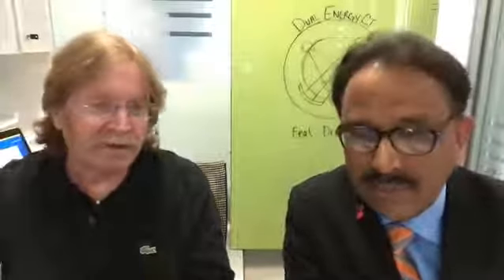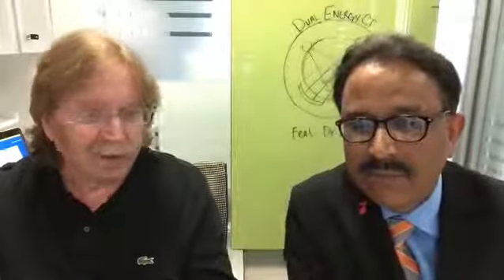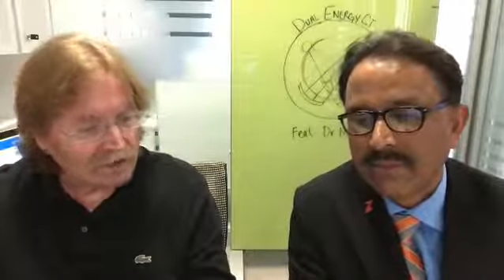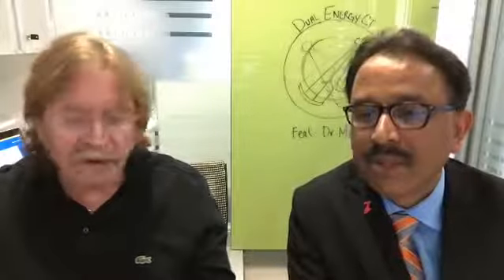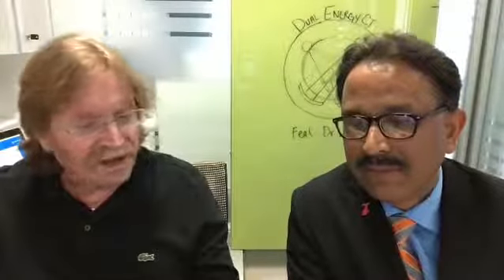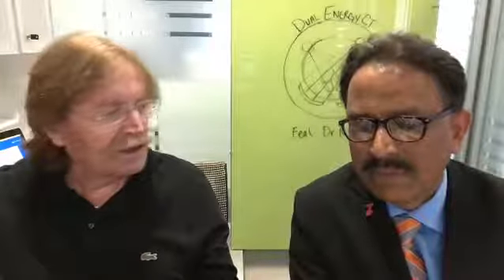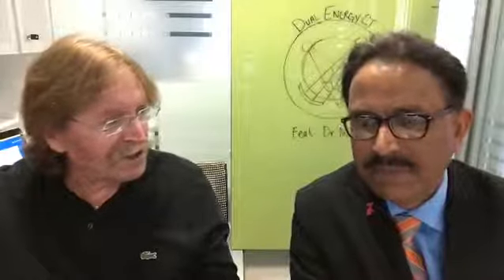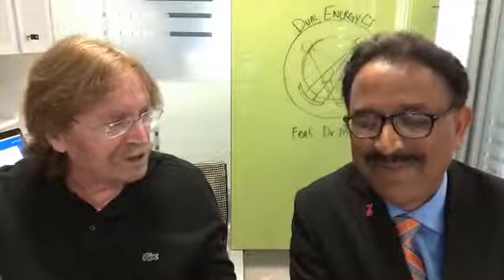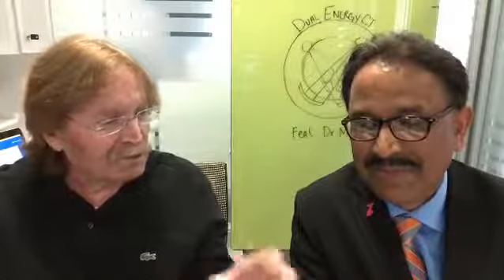So the other question I have is, one of the things people talk about and have published a little bit on with dual energy, and Satomi Kawamoto at Hopkins is looking at response in pancreatic cancer, is can you use dual energy for predicting response and all things like this? There are a lot of things people talk about where two energies or multiple energies would be helpful. The question I have is, let's say we did it on a Siemens scanner with dual energy, and then someone did the same type of process on a GE or a Philips. Would the results be the same?